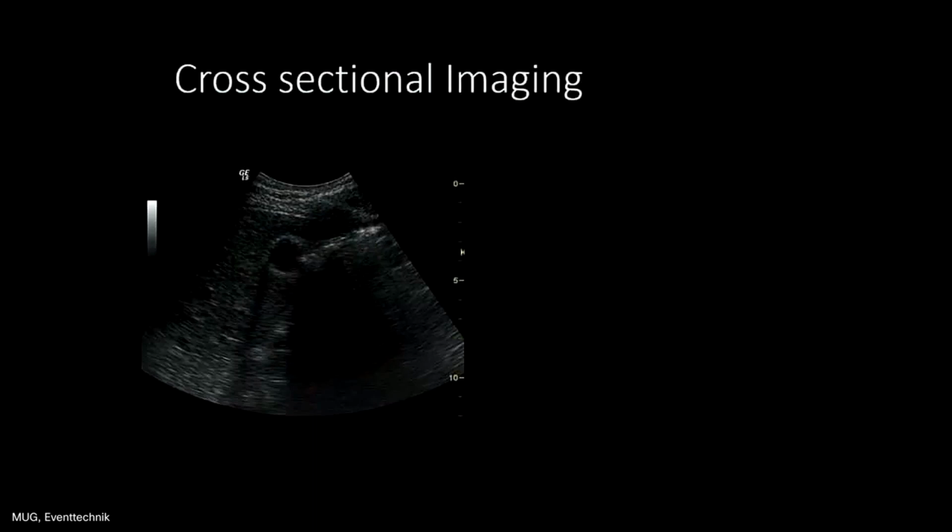Okay. Well, I guess it's a scan of a liver. And we see an anechoic structure with a dorsal enhancement, and with a round shape, which I guess could be the cross-section of a big vessel, like the portal vein, or it could be a hepatic cyst, but actually I'm not quite sure.